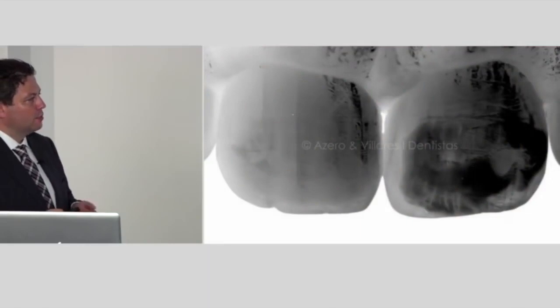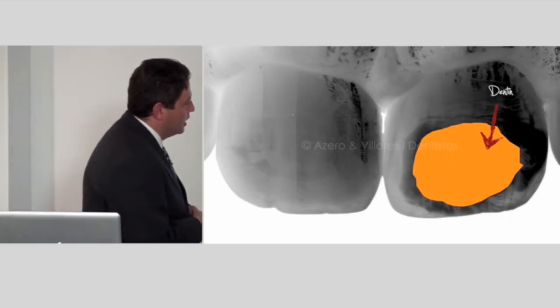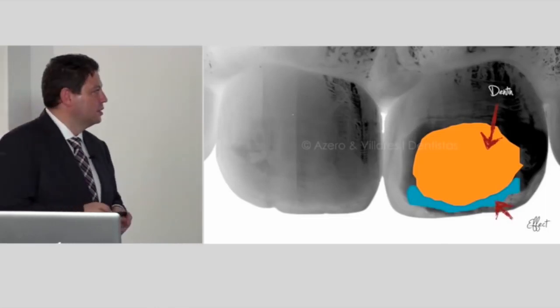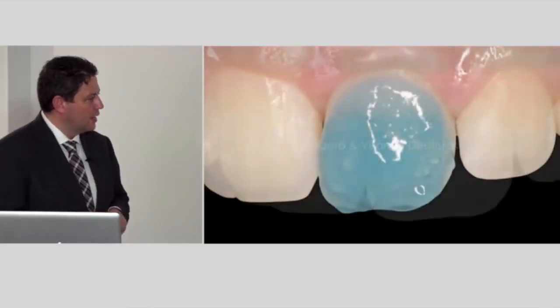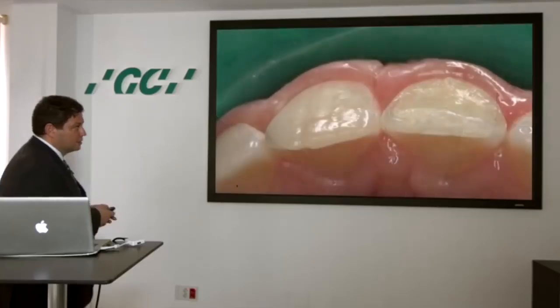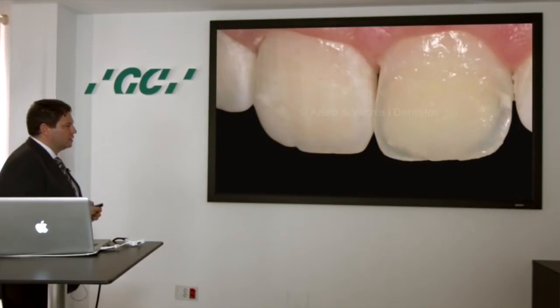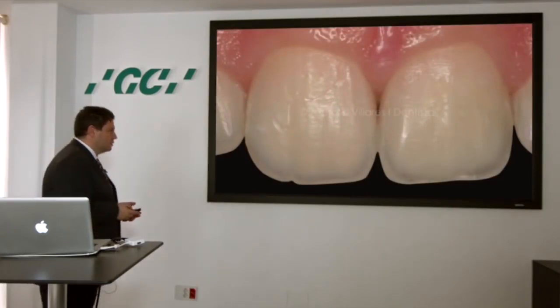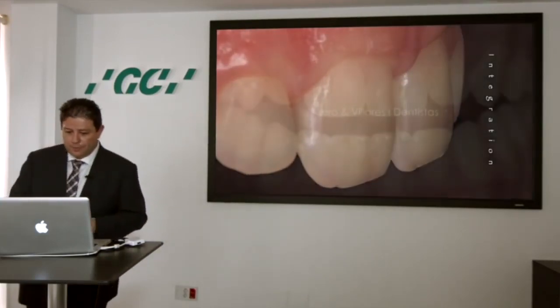What we always do is a protocol that we're going to mention during the webinar. We put dentin, some effects, the enamel, translucent. It's very important to follow the rules: apply the acid etch, the adhesive, know what material you're using, apply, and control the thickness. Very, very important to control the thickness. Now we have tools that allow us to control the thickness more easily. And, of course, reproduce the dental anatomy after the finishing and polishing, and try to imitate as much as possible a restoration that integrates in the mouth.